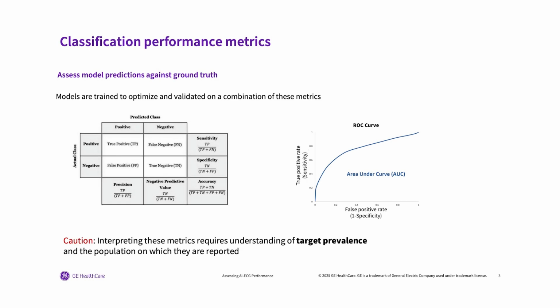Usually what is reported is the classification performance of the model, meaning how well the model performs against the ground truth as it exists associated with its record. And there are many, many data science metrics that characterize multiple dimensions of that. You see them here. I know, arguably, there are too many of them, and not all of them are equally useful or practical.